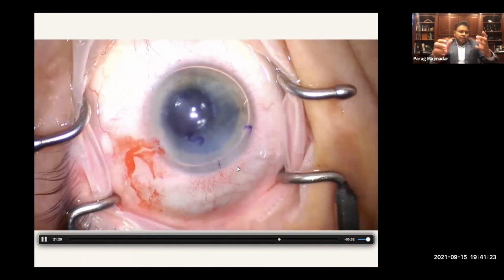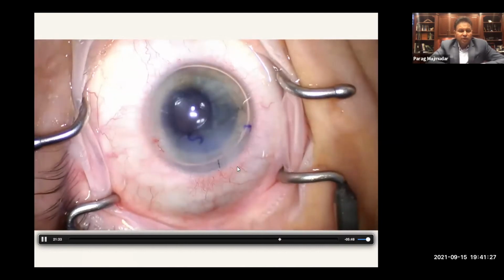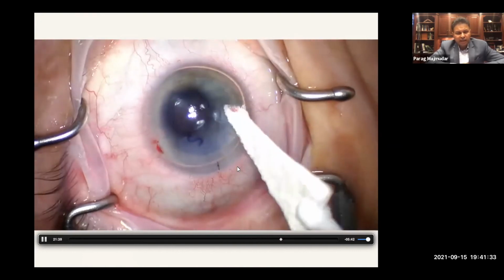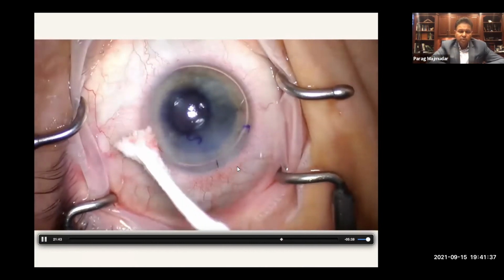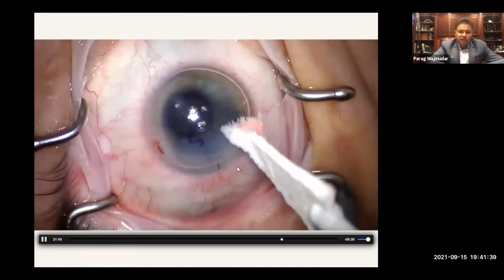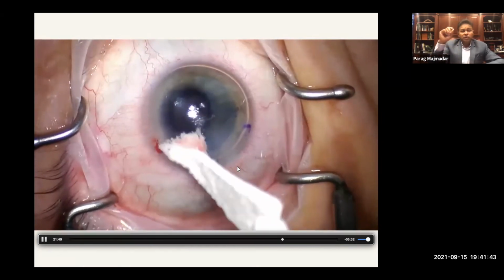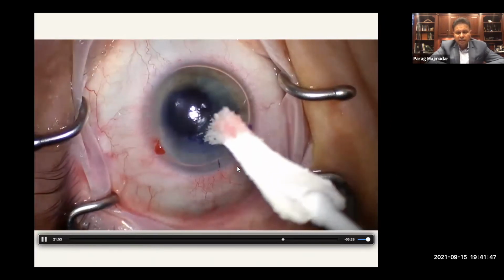So I just had an interesting case today I'll tell you about, or yesterday, where I did a procedure, and I see these patients back in the office a couple hours after the procedure to just check on their pressure. And this lady had a pressure already of 70 yesterday, and I removed a little bit of the gas, got the bubble down to about 80%. The bubble was above the inferior PI. She felt comfortable. Her pressure was back down in the 20s, and I sent her home.